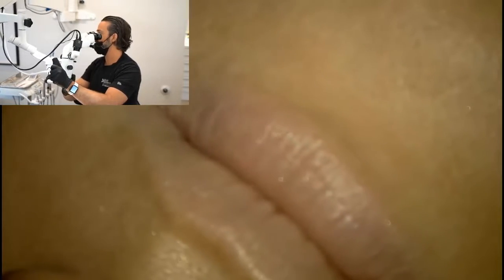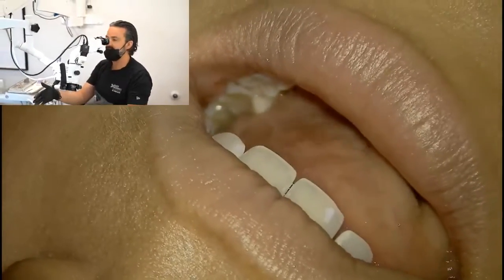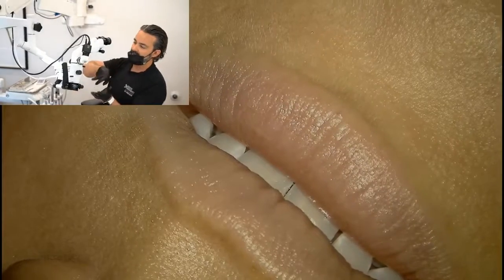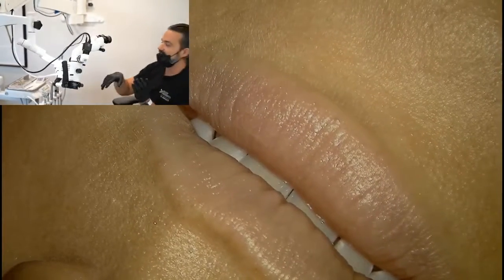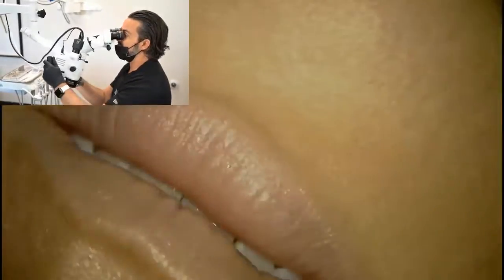That might be really helpful for people who care about where they sit and the ergonomics of their practice. If they're coming off axis like this, these corrections are very useful, as you can see with the different articulation points. And on the lower, it's roughly direct vision.